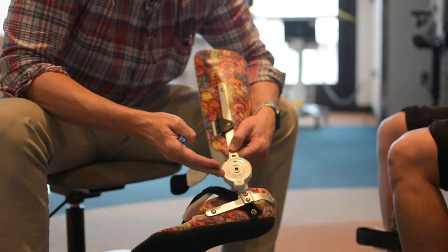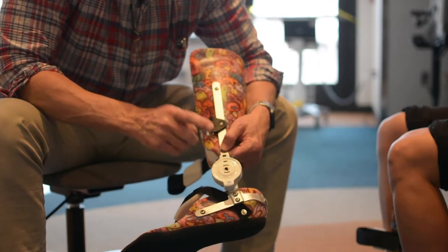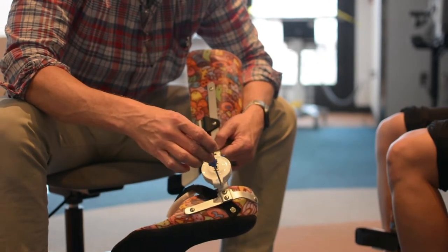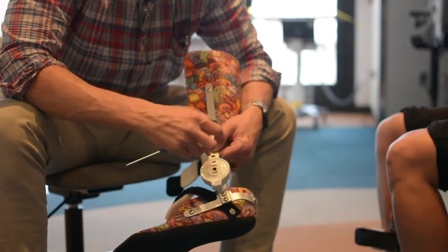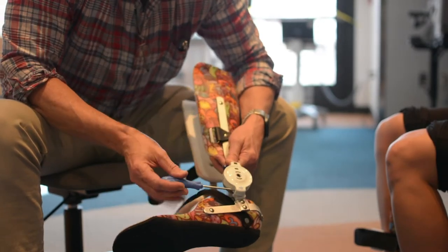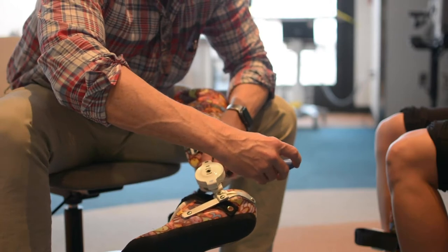On the Ultraflex, it allows you to change the tensions. I really like the new setup because with the old one, lots of people got confused about where the screwdriver went and it would take the whole joint off. The good news is it can only go in one place now — it can go on this side, or it can come in from this side as well.